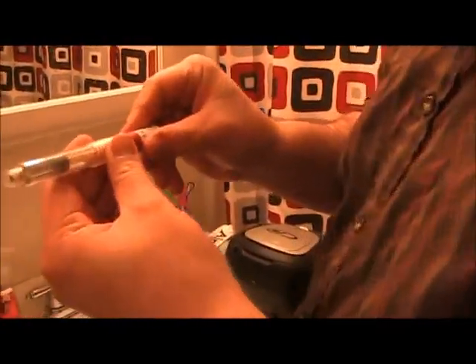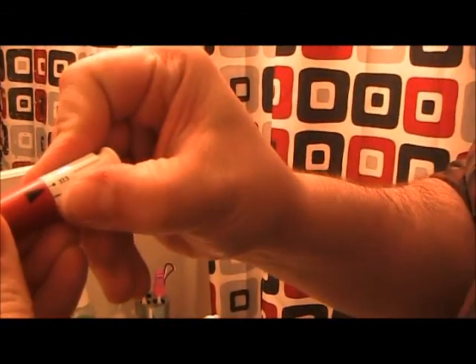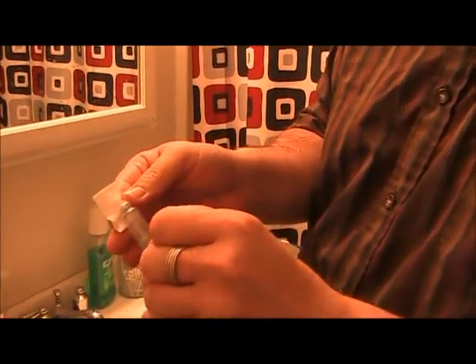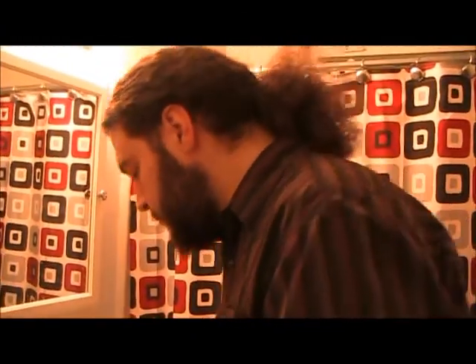So as you can see it's like a pen — it's got a cap, just pull the cap off, and it's got a numbered dial. What we need to do to prime it is turn it to 37.5, and I need to attach a needle — it's a little peel-top like you're opening a thing of milk or something. They want you to use an alcohol swab on the threads, not on the interior, just on the threads. I don't know why, but that's what they recommend so I don't get an infection.